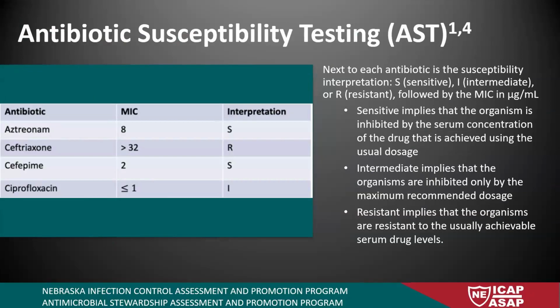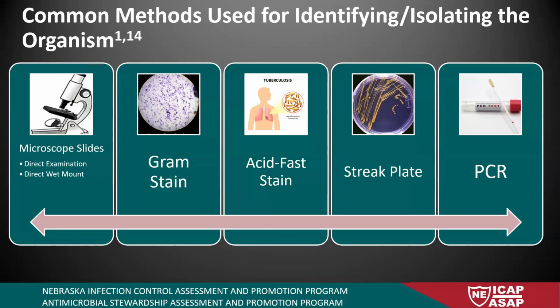And here's some examples of different results that say something is contaminated. Like one urine culture says, mixed microbial flora indicated. If you can't really tell clinically significant, you need to collect a new specimen. So those kinds of things.